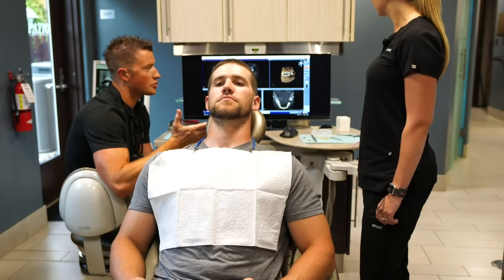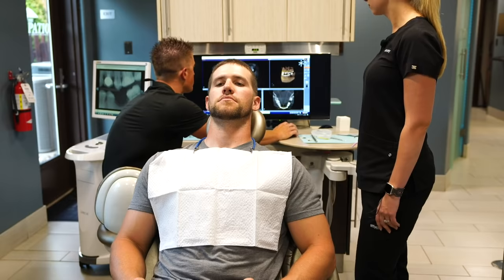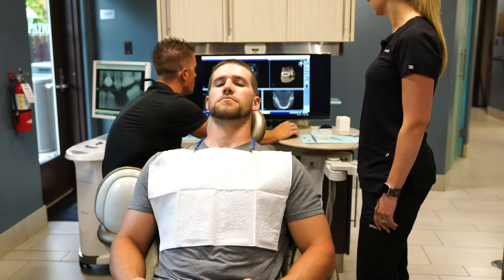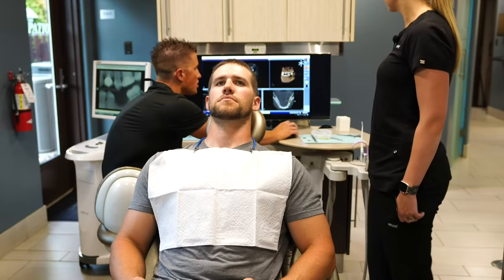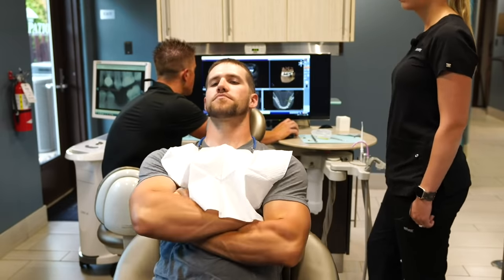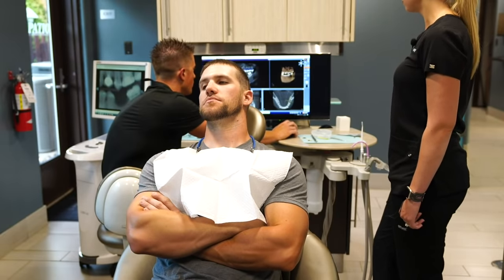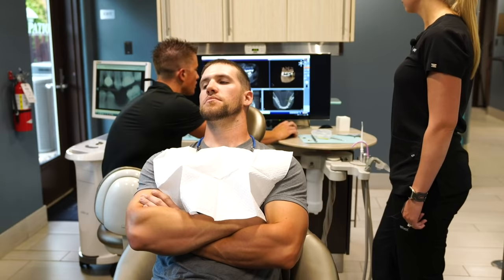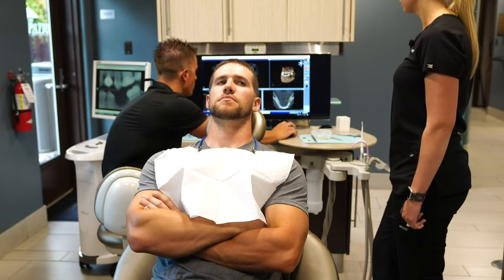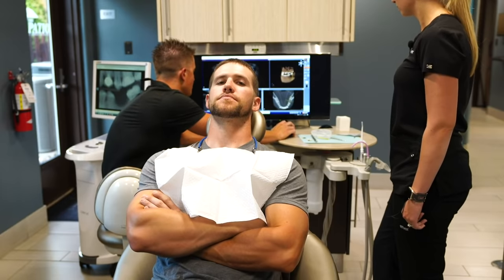Typically, we have to make some sort of incision. What is most common is a large incision made and tissue reflected in order to visualize the bone. Anytime you do a large incision, you're going to have a much greater chance of infection, post-op pain, and a longer overall healing time. I'll talk more about that after I get this planned, since we're already here on planning it. So now I can move this cursor over our implant site.